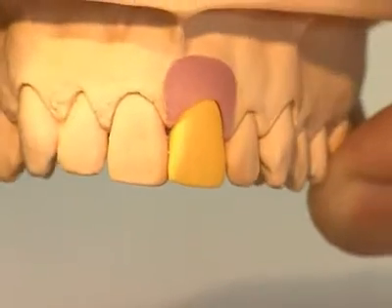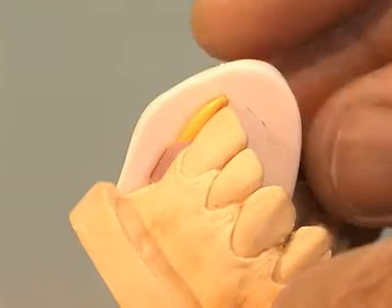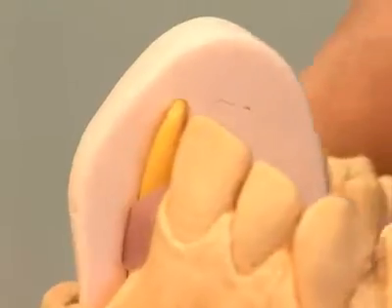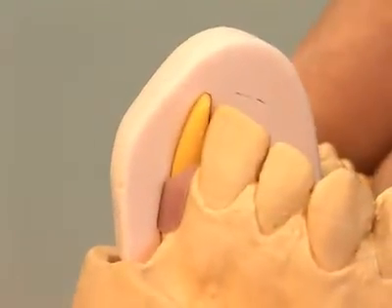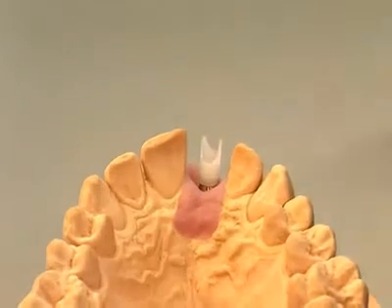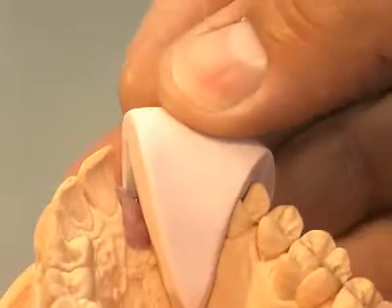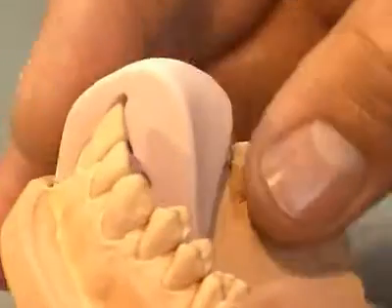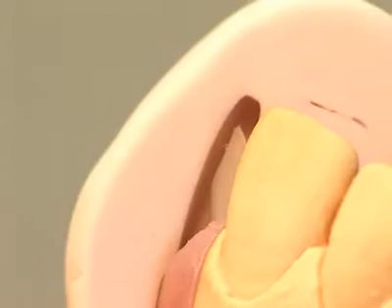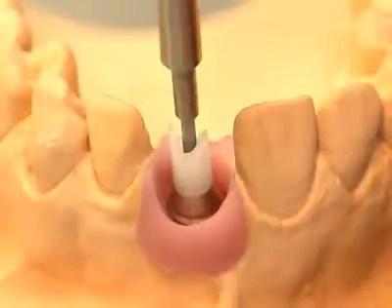Then a silicone key will be made over the wax-up and splinted in two parts to define the optimal wax modulation for the customized abutment. The silicone key shows exactly the space for the cement-retained crown, which will be made over this customized abutment. The modelling aid ensures a clean and sharp-edged finish of the screw channel.